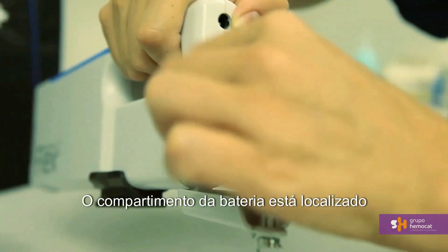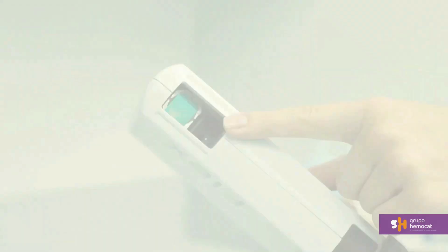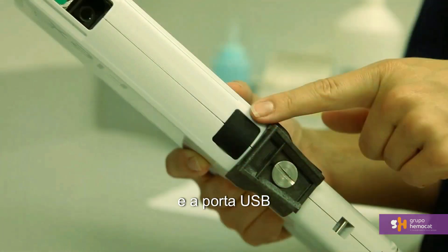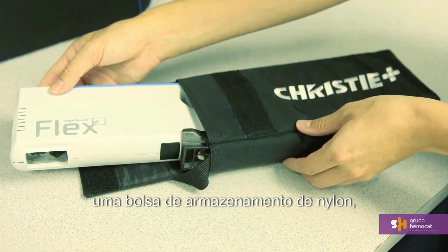The battery compartment is located at the back of the unit, as well as the AC power inlet. On the bottom of the unit, you will find the lens, the mounting bracket for connecting to the S-mount, and the USB port.